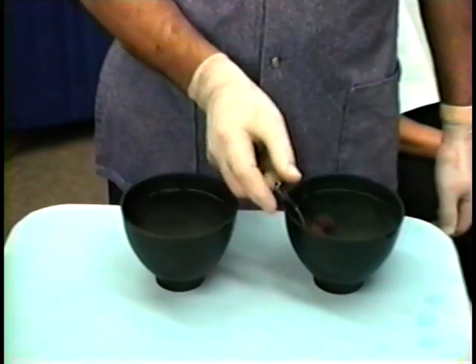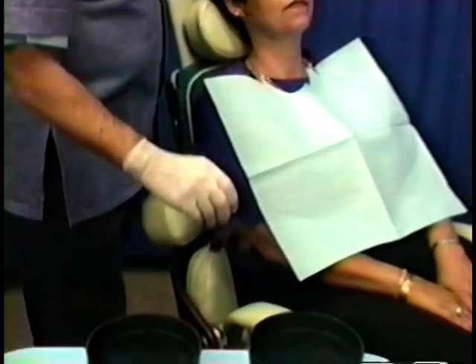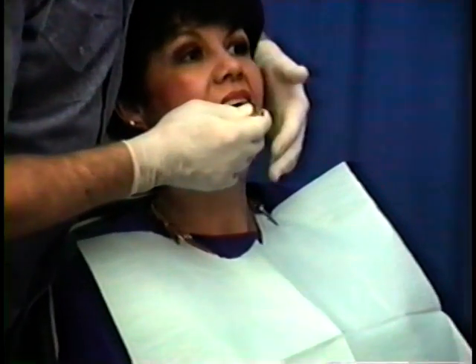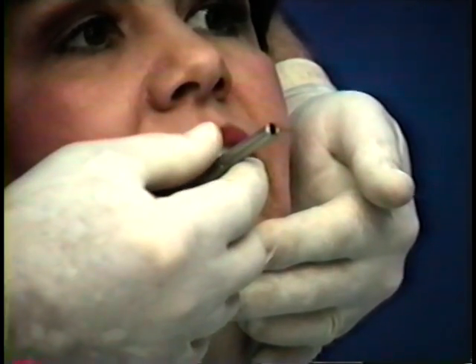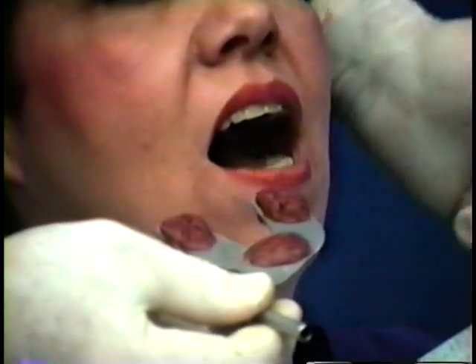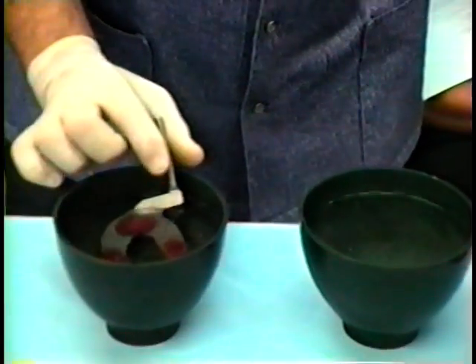Place bite fork in patient's mouth with stem on right side and pointing straight forward. Position fork so that midline mark on fork corresponds with midline of maxilla. Place mandible in retreated position. Instruct patient to close teeth with light pressure into soft compound and then open mouth immediately. Remove bite fork and harden compound outside mouth with cold tap water or compressed air.